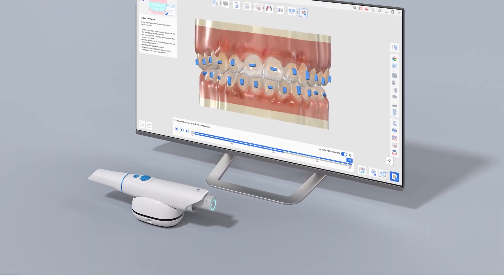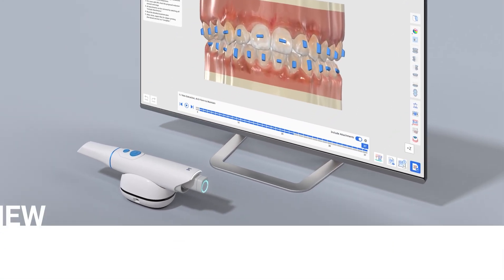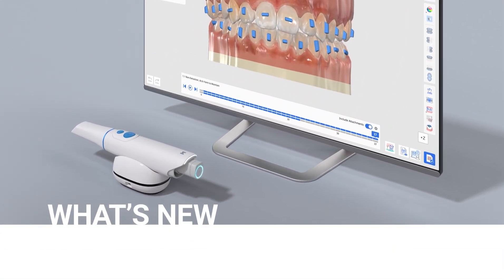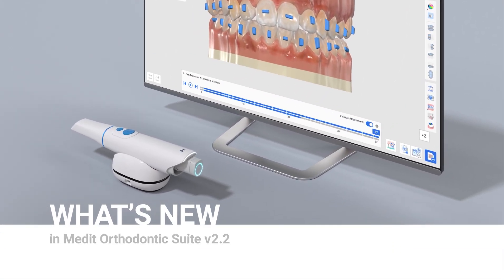This has been a brief introduction of updates in Medit Orthodontic Suite version 2.2. Learn more about digital dentistry with Medit Academy.